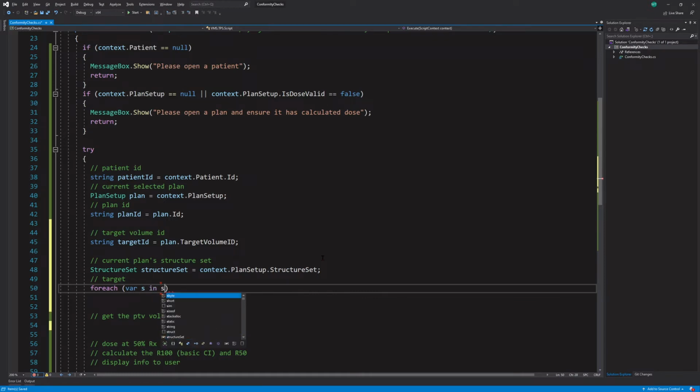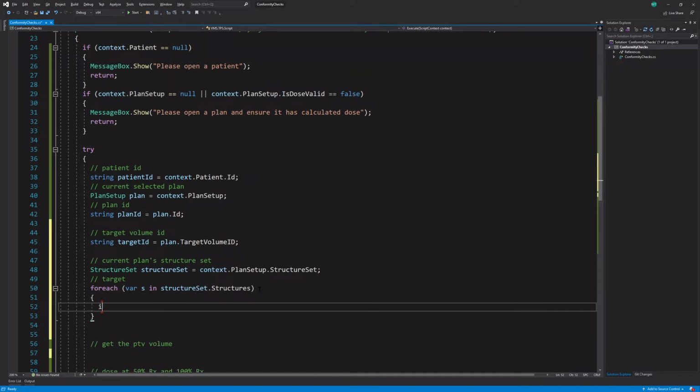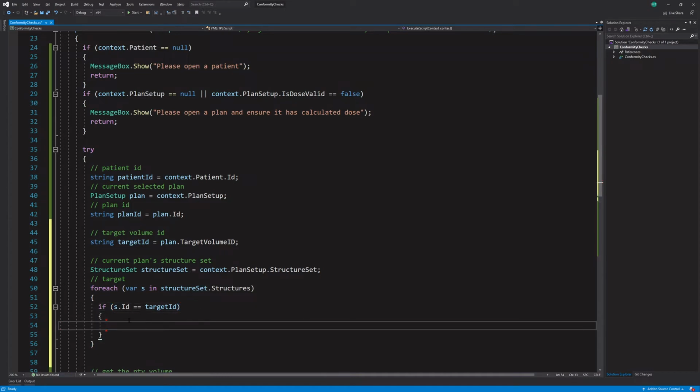But in structureSet.Structures, right? So that's a list of structures. Well, it's an IEnumerable, but this will work. So that means we can enumerate through it. If s.Id equals target ID. And if you're new to C# or programming, in C#, two equal signs means if it equals. So it's like a test. This is like a true or false test. So if this is true, then it will enter whatever logic is inside these brackets. If it's not true, it will skip it.